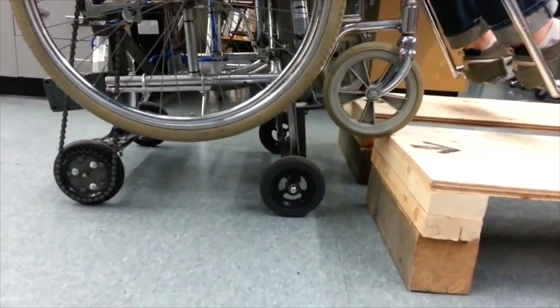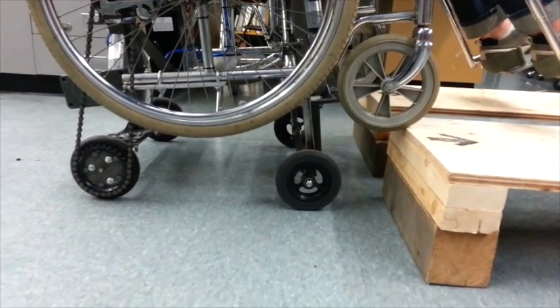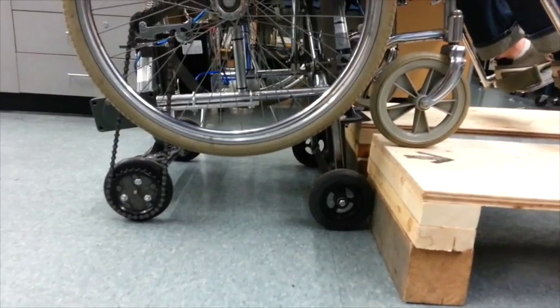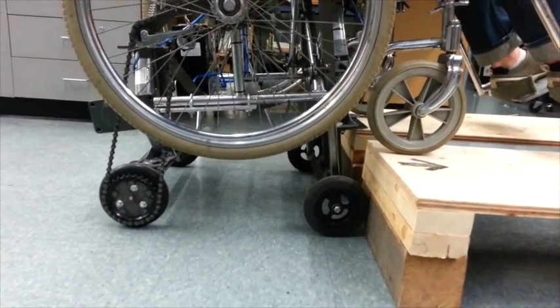For taller curbs, the rear axle may need to be lowered slightly to achieve the proper height for the front wheels. Once the front wheels are at the proper height, move the chair forward once again until they are on the curb.